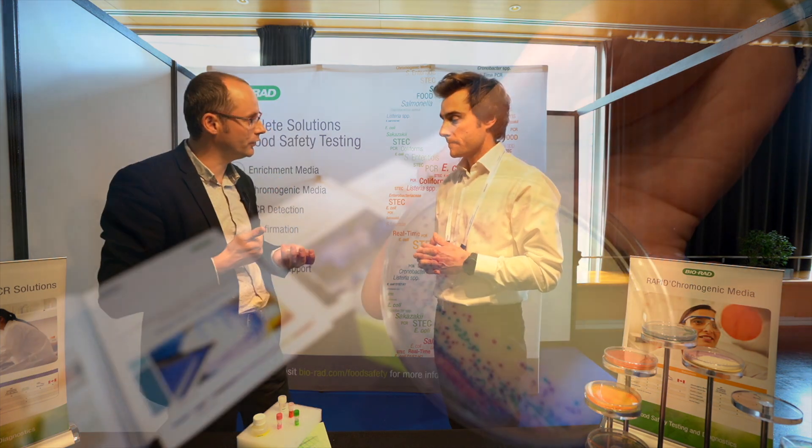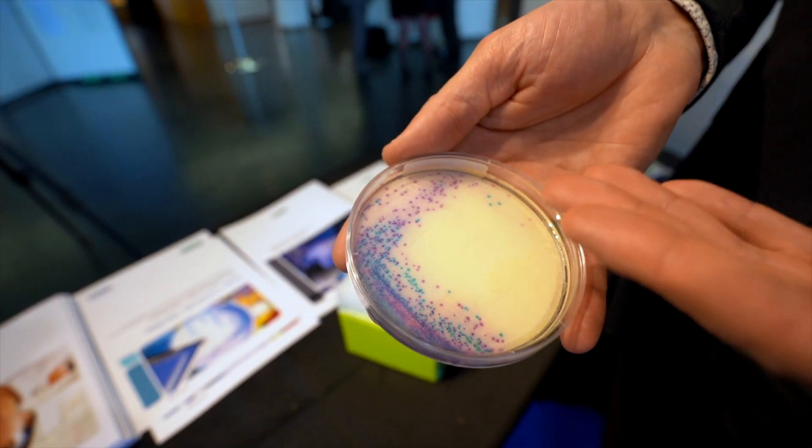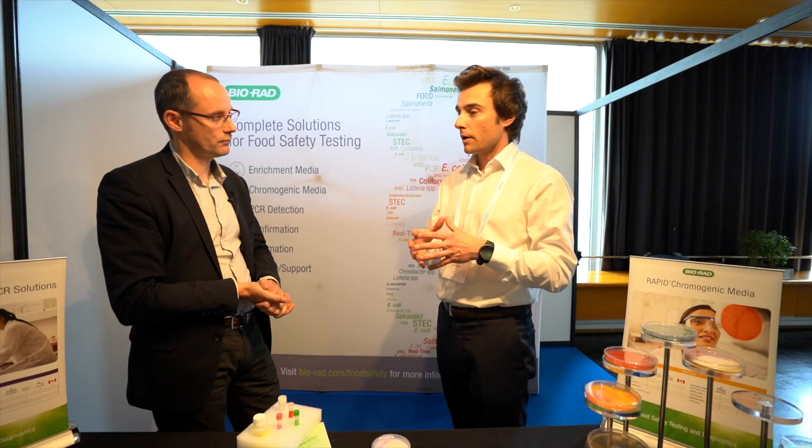So we are using a counter-selection based on a blue chromogenic. That means that you can have a differentiation between the Salmonella and the other kinds of enterobacteria. Can you tell me about the workflow?